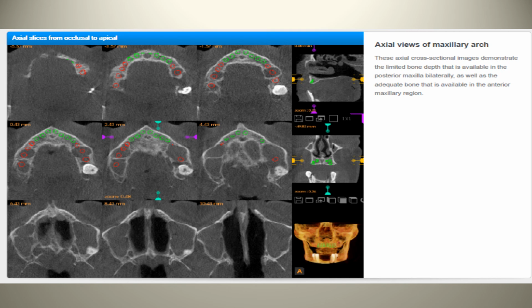And from the cost perspective, when you start breaking down the business side of the profession, a typical CT scanner, at least a good one, you're looking at at least $100,000 plus the regulatory aspects of having it inside your office. Not to mention, you need to have a computer or an acquisition station. You need to have up-to-date software. You need to train your staff on how to use it, and whatnot.